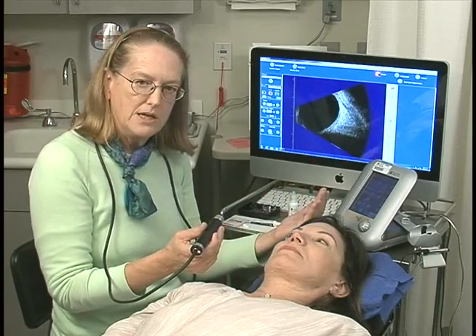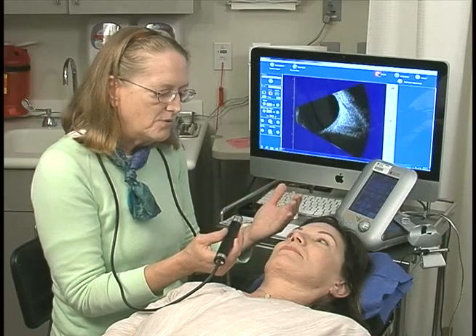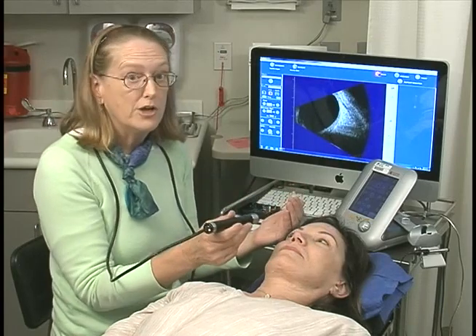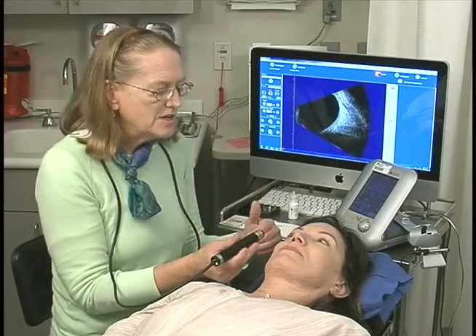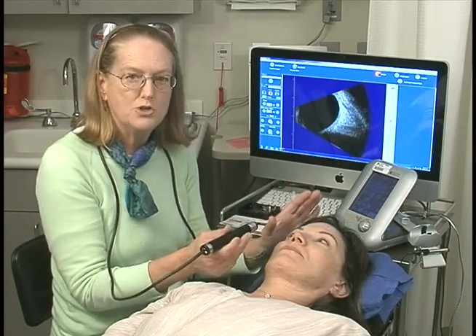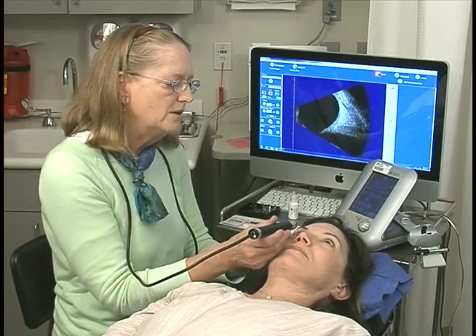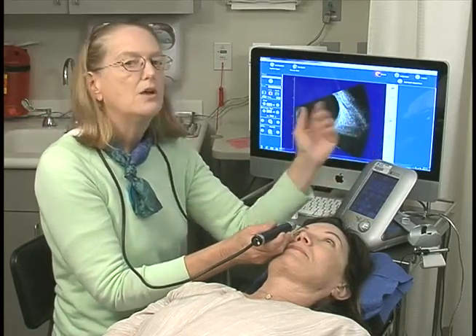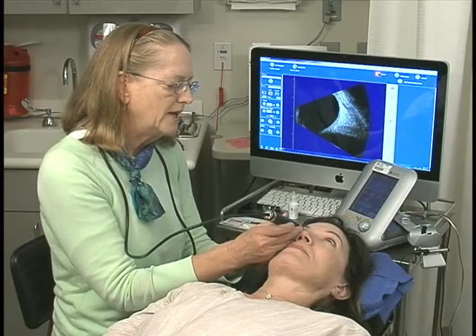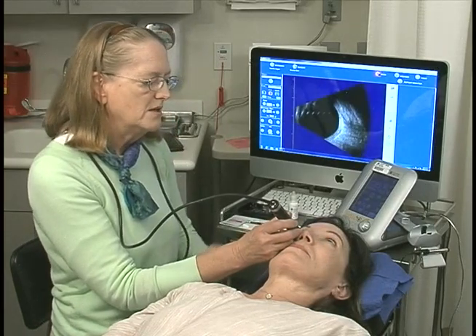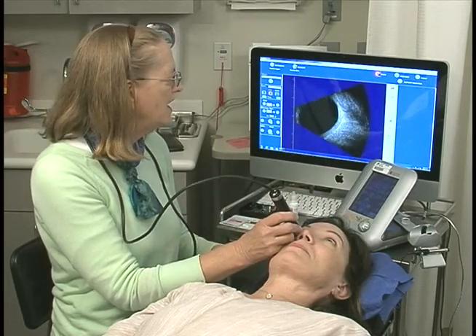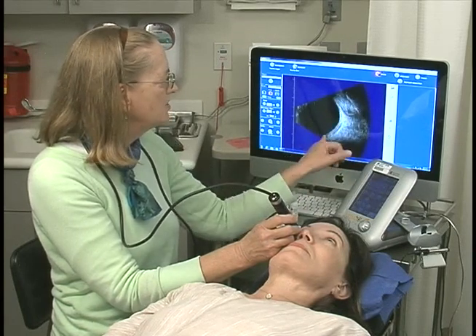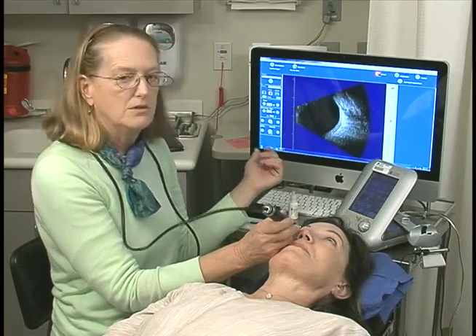I'll look at the other meridians with longitudinal as well. If it's a diabetic with a hemorrhage or a high myope with a potential retinal tear, I will look at every clock hour or every one and a half clock hours. But for this demonstration, I'll show you the other three major quadrants. Look straight up now — we're going to look at a longitudinal of 12. The farther away the patient can look from the probe, the more anterior peripheral the sound will get. The probe is placed with the marker pointing at 12. Here's the optic nerve at the bottom. We now have the superior rectus muscle at the top — so posterior, anterior — that's a longitudinal of 12.